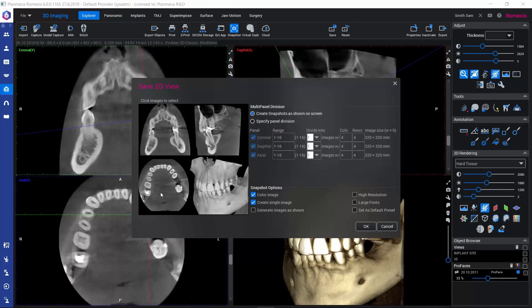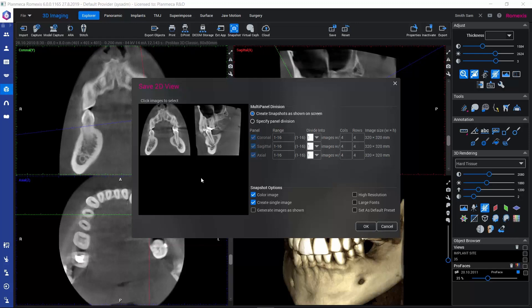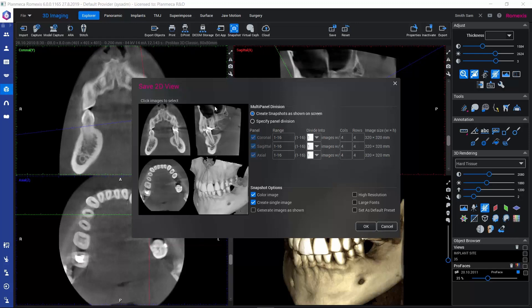First, we can determine which views would be included in the 2D snapshot. If we would like to exclude, for example, this 3D rendered view, we can click on that or the axial view. Now we would be saving only these. Or we can click back here in order to include these views again.